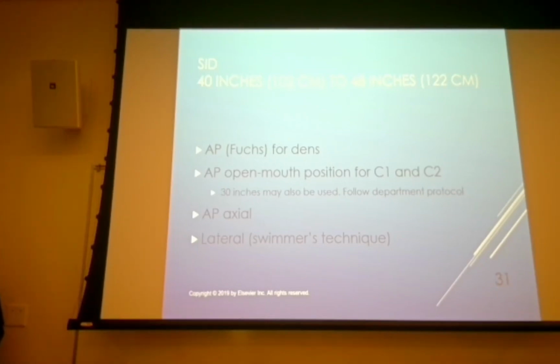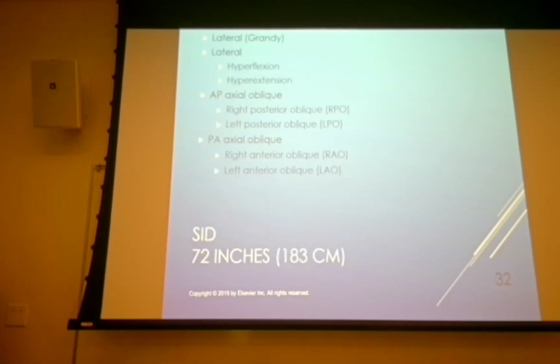We can use less than 40 inches, and I'll explain that when we get to the open mouth odontoid here in just a minute. But in all cases, of course, what you want to do is follow hospital protocol.